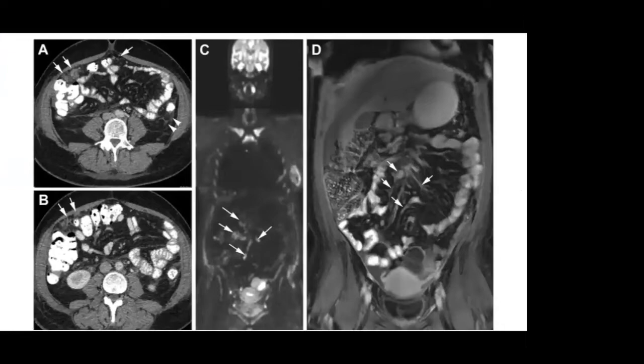This is again an example, and this also illustrates what we're actually looking at. So again, CT shows this omental disease, and then looking at the whole body MRI, we see this restriction here, and here, and here. So this is the mesentery lying over the jejunal and the ileal arteries, in effect. And we can also see these linear and nodular deposits there. And that was in fact confirmed during surgery that it was involved.